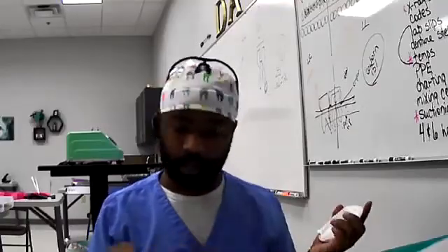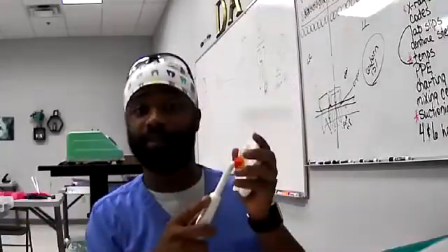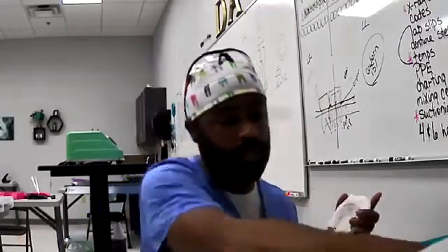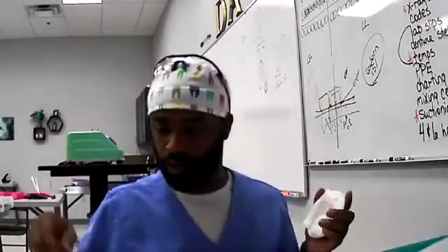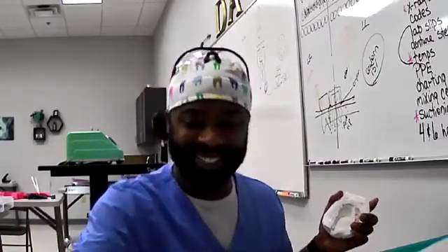Okay. Cure your pack, cure it 20 seconds with the curing light. Once we've done that, I'm sorry, I've got to get way more organized.